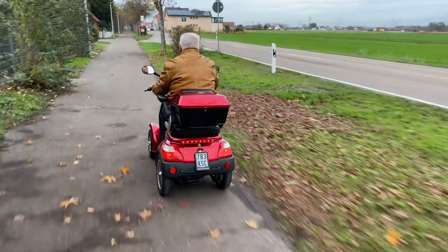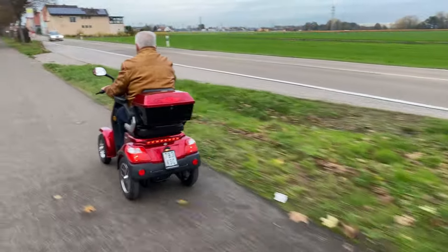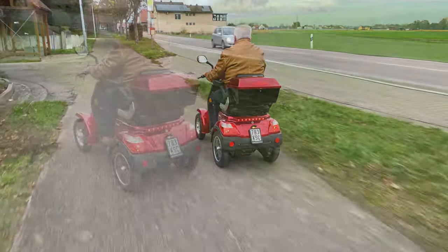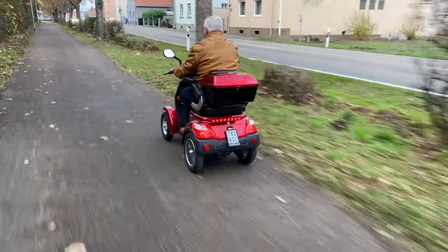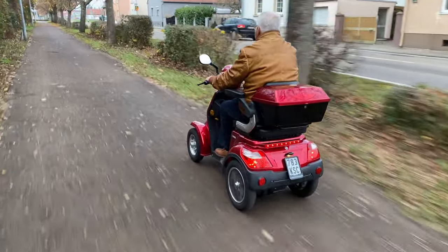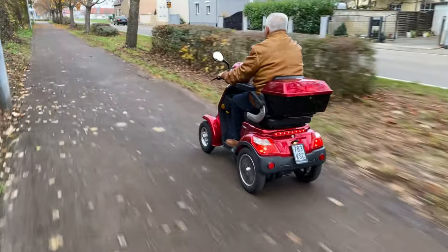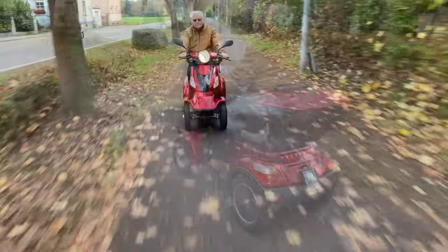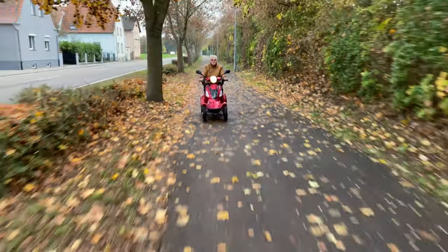Everyone has to decide for themselves whether a speed of 15 kilometers per hour is sufficient or whether it should be 20 or 25 kilometers per hour. For my father, 20 kilometers per hour is sometimes a little too slow, but doing without a belt or helmet outweighs it — because 25 kilometers per hour requires a seat belt or helmet.